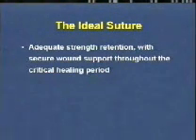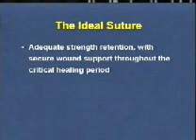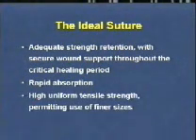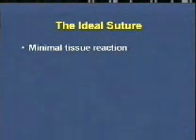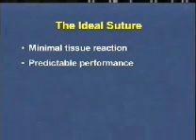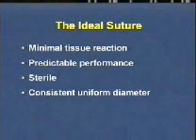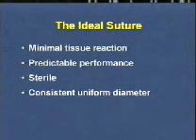Since Lord Moynihan's definition of the ideal suture in 1912, it has been accepted that his criteria represented an impossible dream. However, advances in suture material technology over the years and, in more recent times, new developments in absorbable suture technology are bringing the concept of the ideal suture ever closer. Because the ideal all-purpose suture still does not exist, the surgeon must select a suture that is at least as close to the ideal as possible and provides the suture qualities shown in the chart.